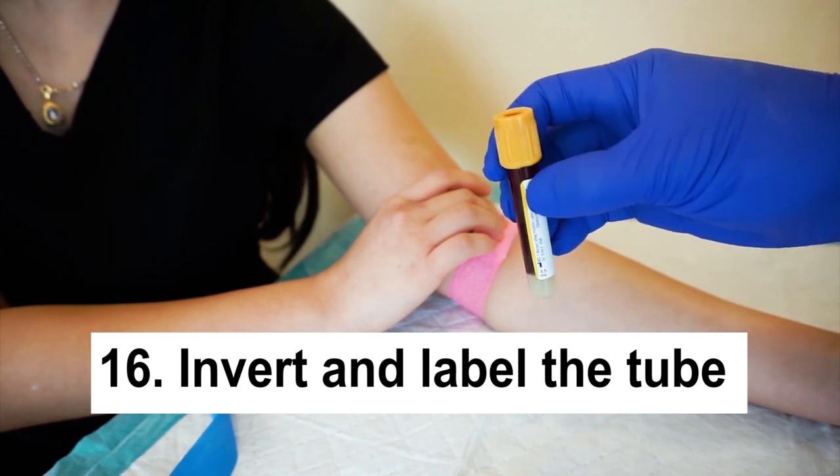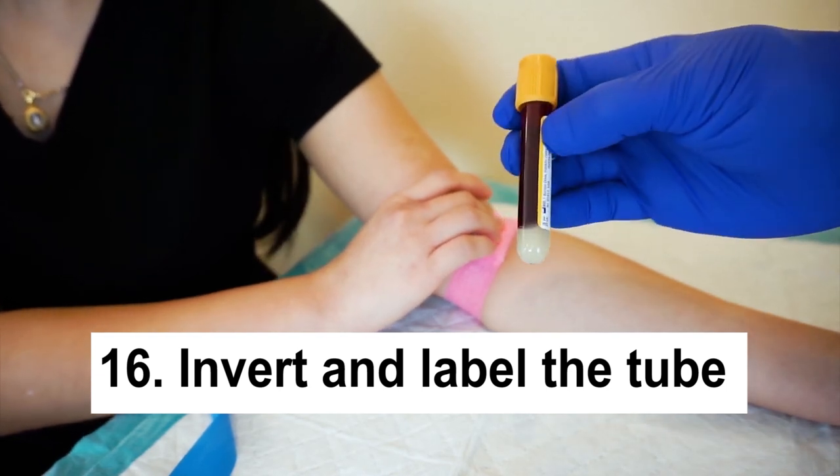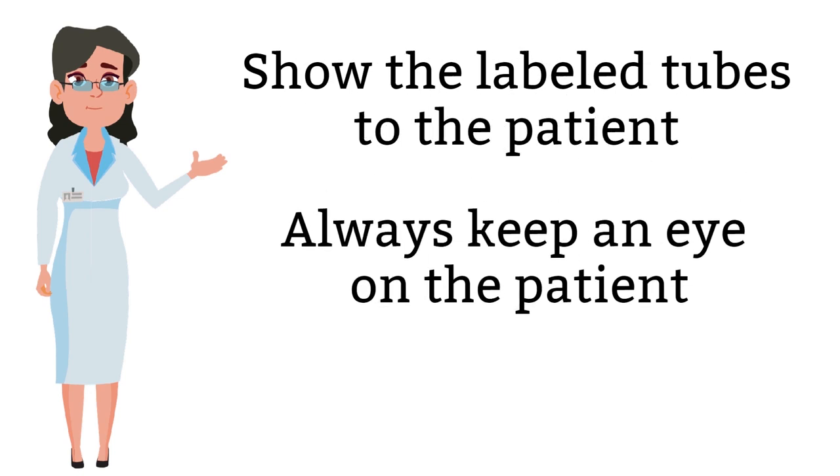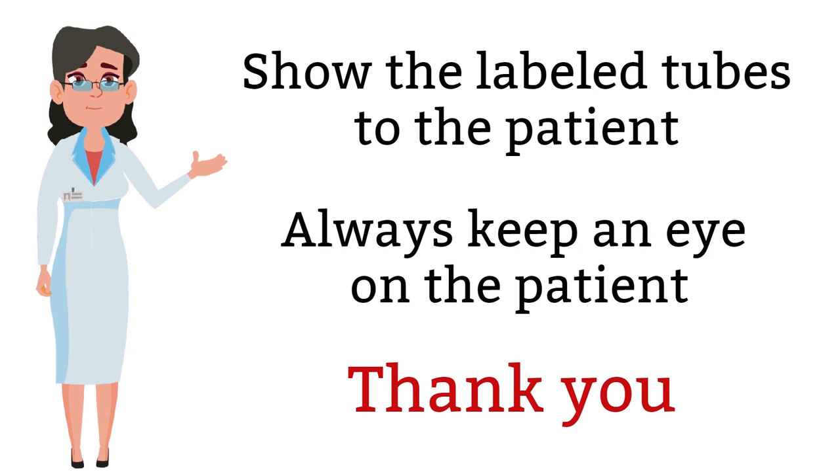Sixteen, invert the tubes a few times and label the tubes with the patient's information. Generally, on the label, you should include your initials, date, and time of draw. As soon as you are done labeling the tubes, let the patient take a look and verify that the information is correct. While you are doing this, you will also keep an eye on the patient, making sure that the patient is doing okay and not fainting.